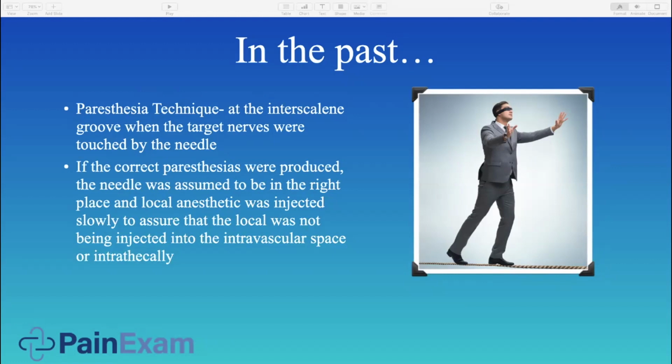It was at Bellevue where we were using the ultrasound, and we brought this to the other hospitals in the NYU system, and it spread from there. However, when I was in my pain management fellowship, ultrasound was not there. It was a fluoro-based traditional pain fellowship, but there was a lot of encouragement to explore, to learn, and therefore I integrated ultrasound into my practice as an anesthesiologist as well as a pain doctor.